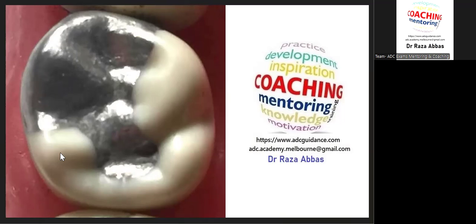And then fracture. We have seen candidates saying that the amalgam restoration fractures while I'm carving or while I'm removing the band. Now, please remember to make sure to condense the amalgam really well when you are condensing, and condense in all directions, vertically, horizontally, obliquely, towards the contact point, everywhere. Condense really well. Make sure to condense as much as possible. I remember when I used to do this task, I used to condense. I never had any problem. This is my favorite task actually.